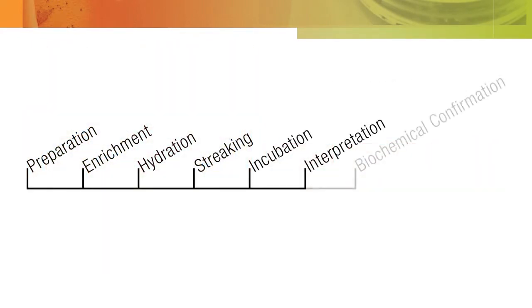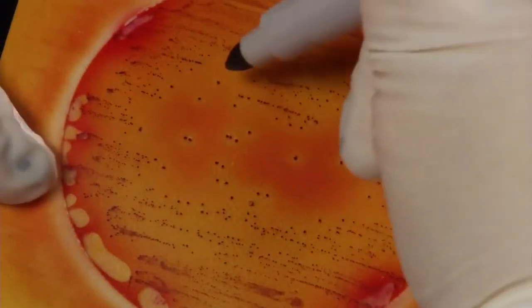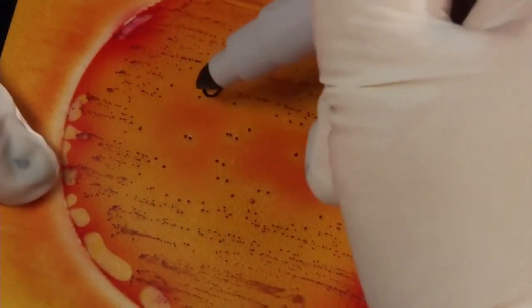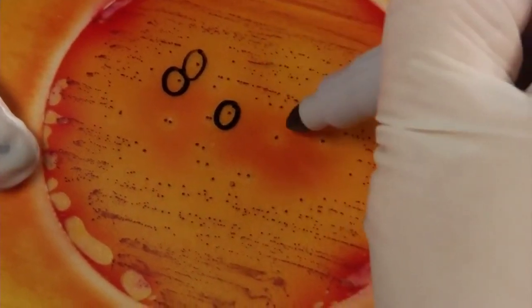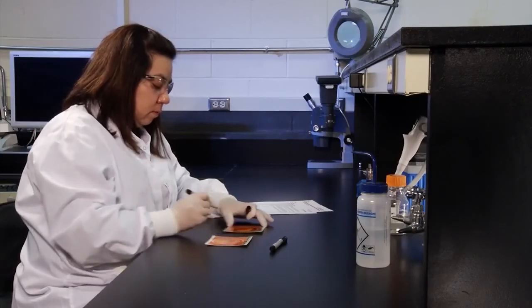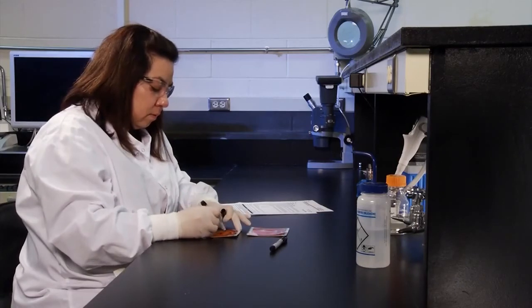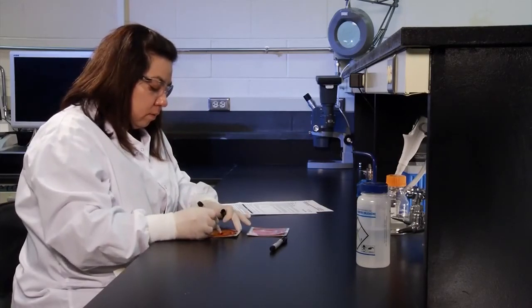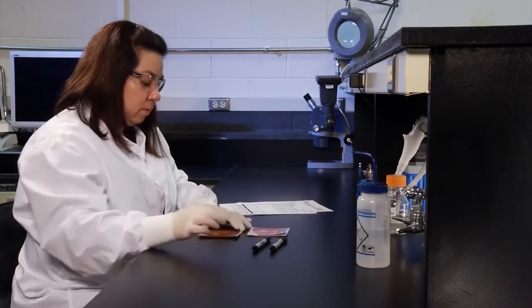If you have found presumptive positive salmonella colonies, perform the following steps. First, take out a permanent ultrafine tip marker and circle a minimum of five isolated presumptive positive colonies on the 3M Petrifilm Salmonella Express plate top film. Second, biochemically confirm all circled salmonella presumptive positive results using the 3M Petrifilm Salmonella Express Confirmation Disc.